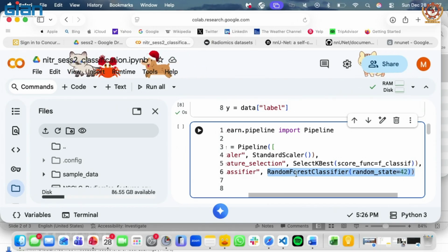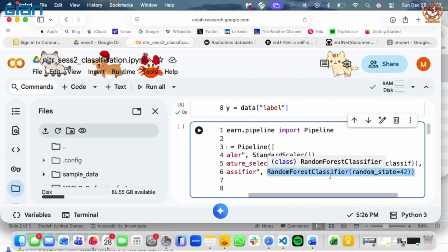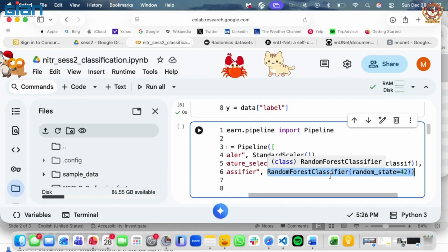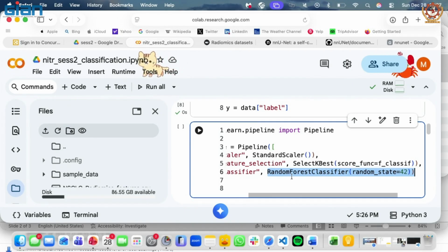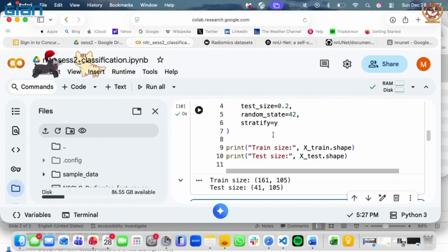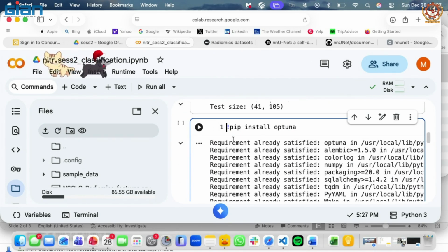This is the pipeline. My random forest is one of the best classifiers that you can use. You can also use support vector machines or decision trees. You don't have to write code for anything. They are already there in sklearn. So you can just pick and play with these classifiers. But what I would suggest is, don't spend too much time experimenting which classifier is working the best.